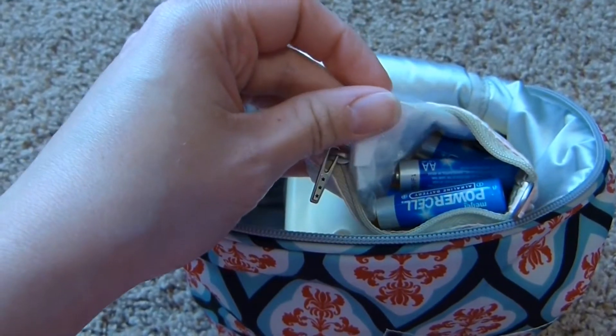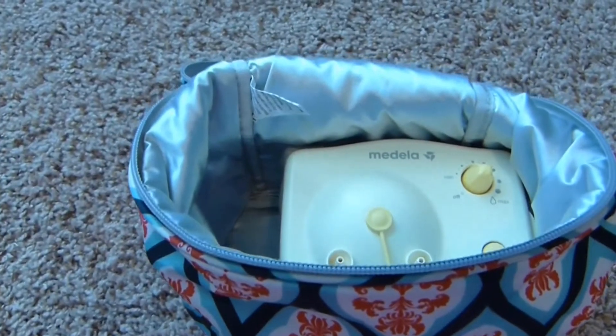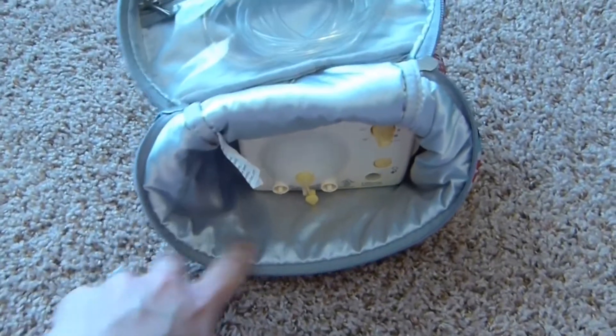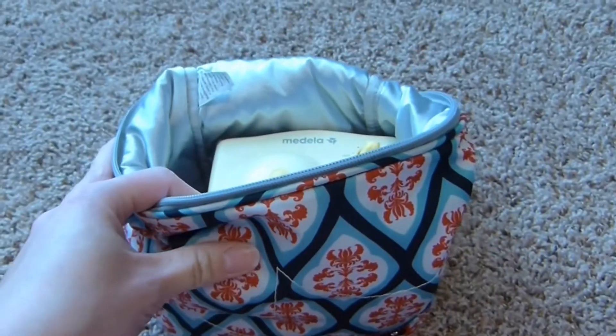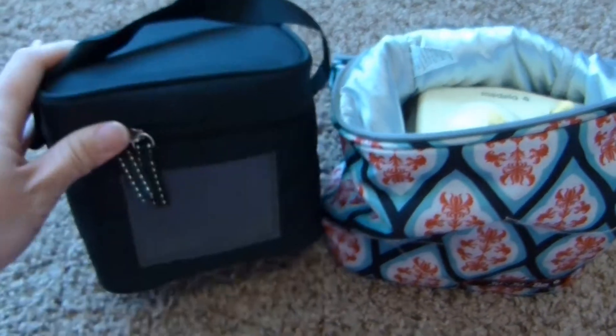I also have a little baggie in here that has some extra membranes in it, just in case one of those breaks while I'm at work. To use the pump, which is in here, I just flip it over like this and hook everything up. And then when I'm done, it all fits nicely back in there.